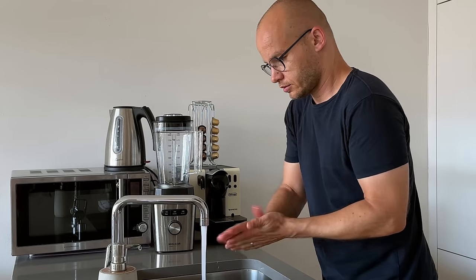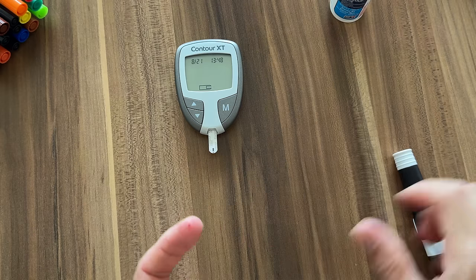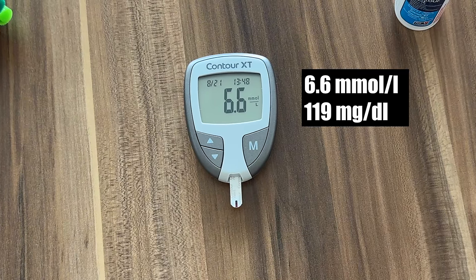Our first blood sugar reading is going to be our baseline. I washed my hands with warm water and soap, dried them with a clean towel, and pricked my finger. The first reading is 6.6 millimole or 119 milligrams per deciliter. This is a good baseline.